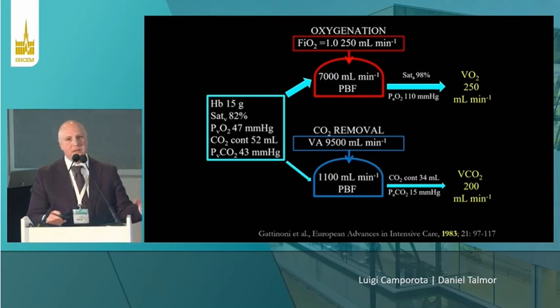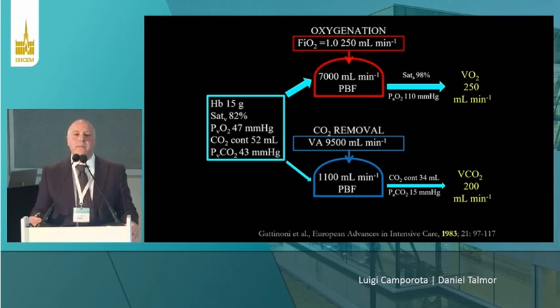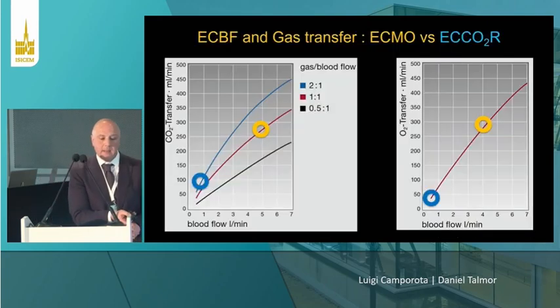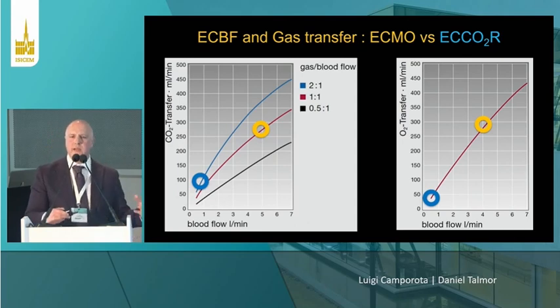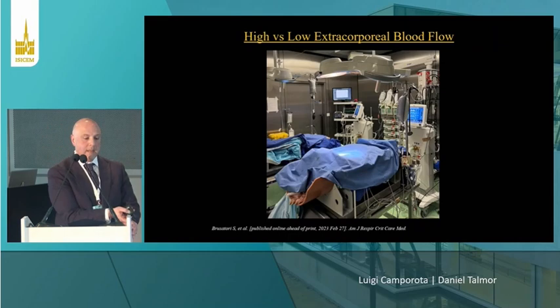So it's very clear, and I'm not going to spend any time on this because it's been discussed in the previous talks, but essentially we can remove carbon dioxide to the level required to maintain or control ventilation just with a much lower blood flow compared to ECMO. And if we look at this graph here, you can see this is blood flow, again on the right and on the left, and you can see that at a low blood flow, this is like extracorporeal CO2 removal level, the amount of oxygen transferred through the membrane is incredibly low, so not enough for oxygenation. But you have seen that at the same level of blood flow, the CO2 removal through the membrane lung is still significant to allow reduction in intensity of mechanical ventilation.